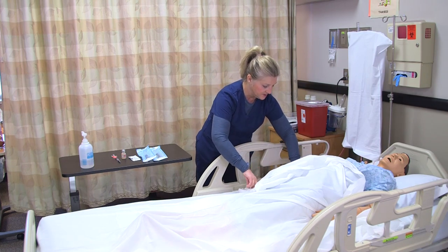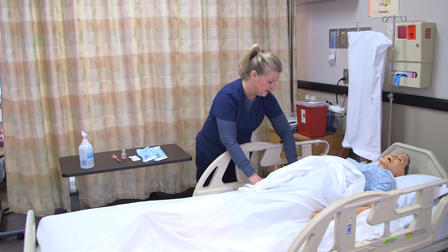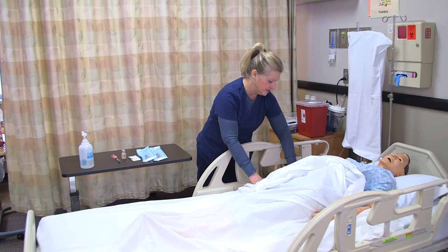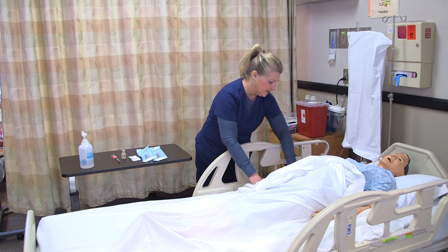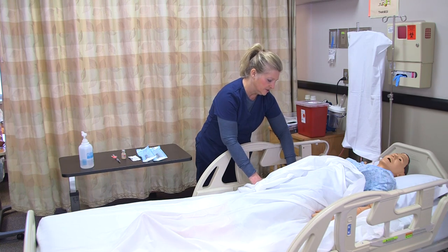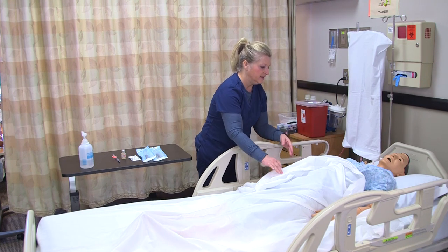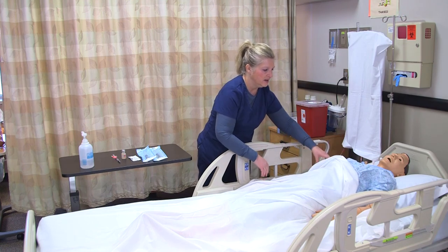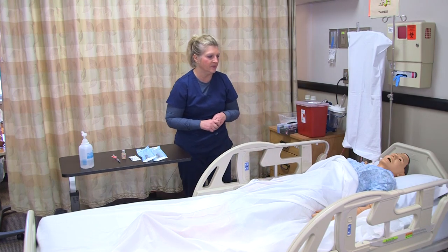I note the wristband and I ask the patient for his full name and date of birth, and if he has any allergies. I check that against my EMR and everything checks out correctly.